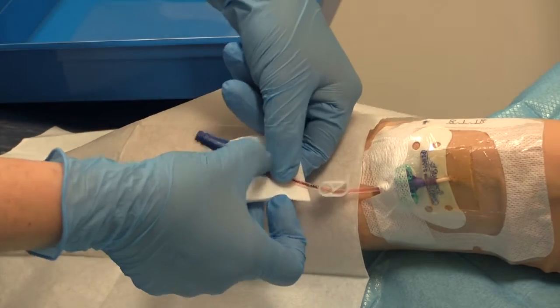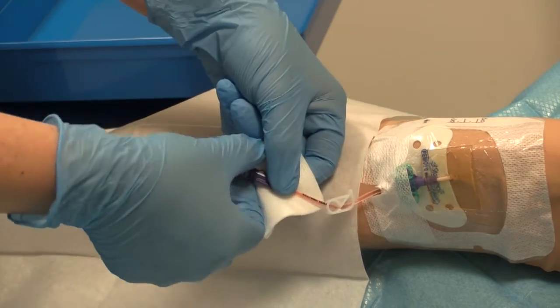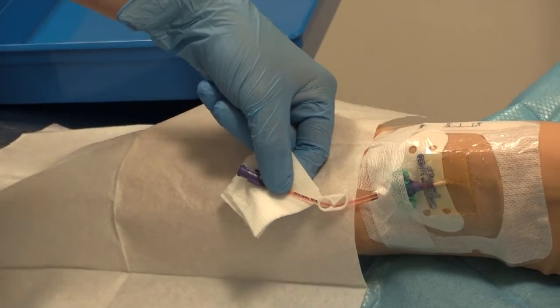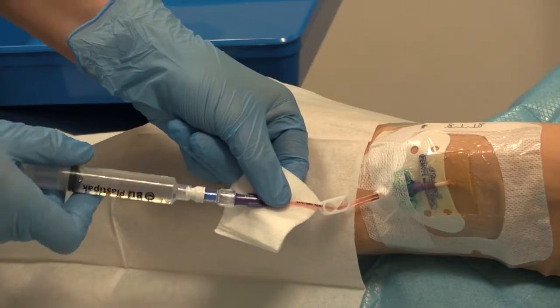The needle-free valve is suitable for 7 days or 100 uses. If the flushing coincides with when a needle-free valve needs replacing, this can be done now. The old needle-free device can be removed, and the already primed syringe and smart sight can be attached in one action.